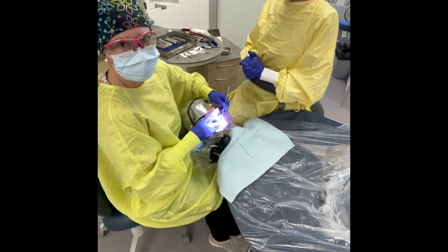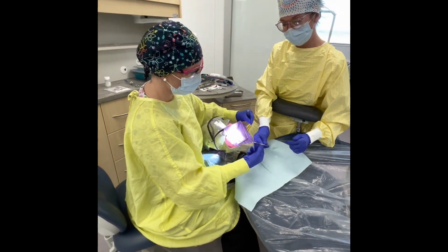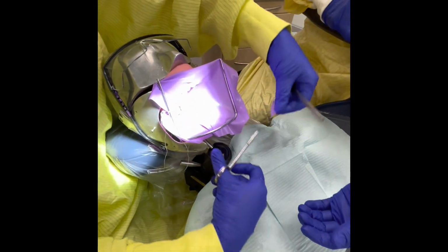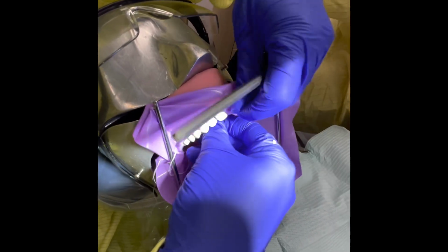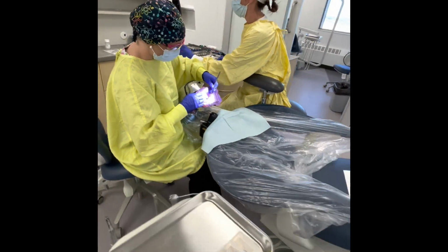So for the purpose of today, what we'll do is we'll end up just cutting a section of the dental dam as our ligature. So Stacy's just going to pass me the scissors. I will cut a small section of the dam. Pass the scissors back to Stacy and place my ligature. Okay, and we are ready to proceed with preparing the filling.